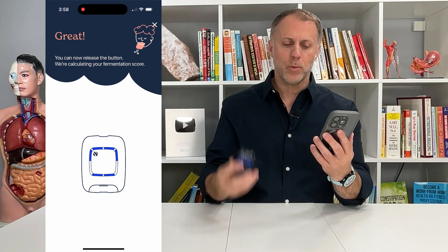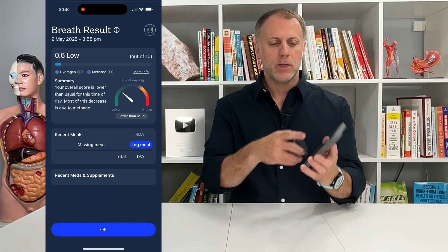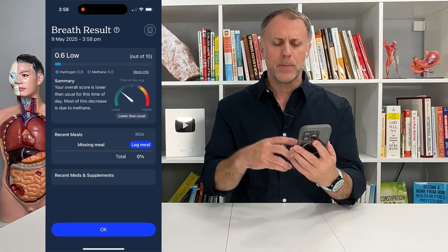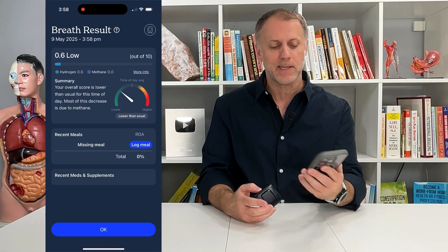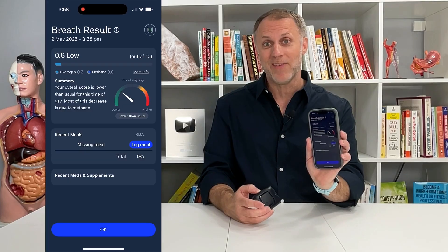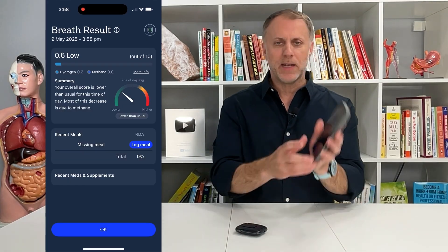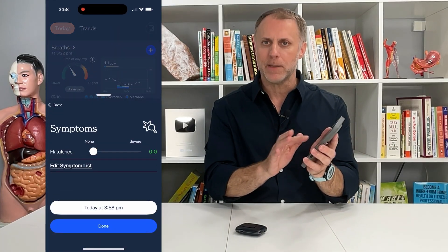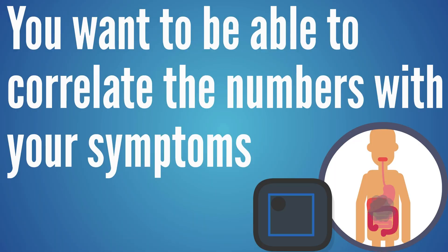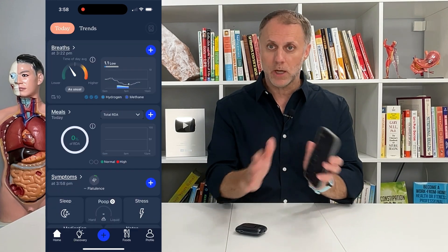It'll buzz again when it's done — that's when you stop breathing and let go of the button. It then gives you your score. I got a 0.6, which is really low. Most people that are having a problem are not going to see a 0.6. But that's what you want to shoot for. Then you can say okay to save that number, and it'll ask if you have any symptoms so you can correlate your symptoms with the numbers you're getting. I'm not having any symptoms so I'll just say done.